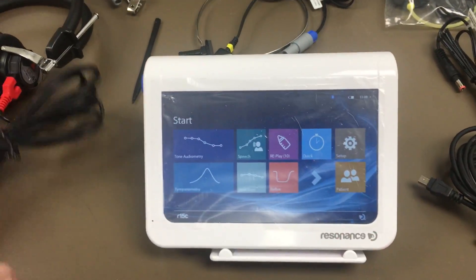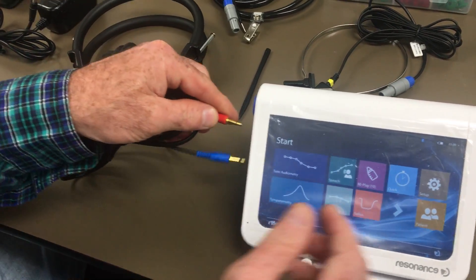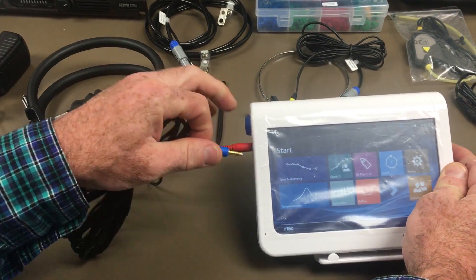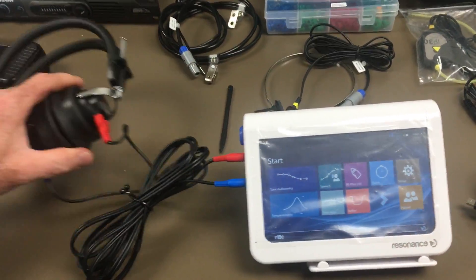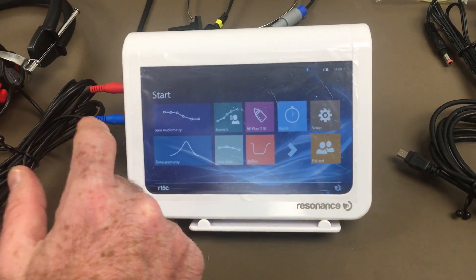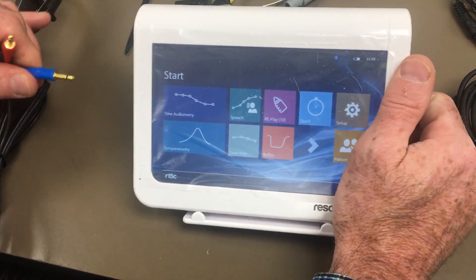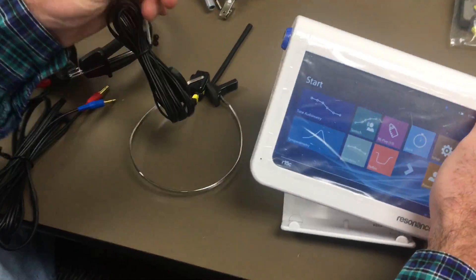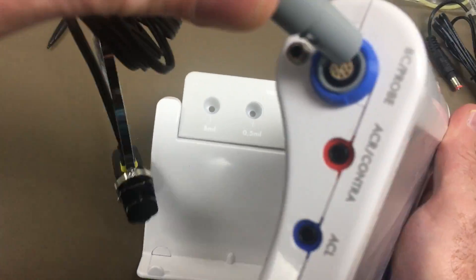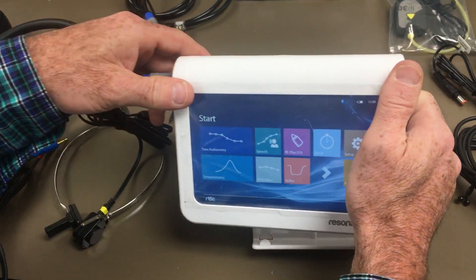This is where your headphones hook up when doing any kind of audiometry test — just plug them in right there. For bone conduction, it simply fits right in the slot; you'll see a little groove at the bottom with arrows. Plug it in and it's good to go, and you can then do your bone conduction testing.